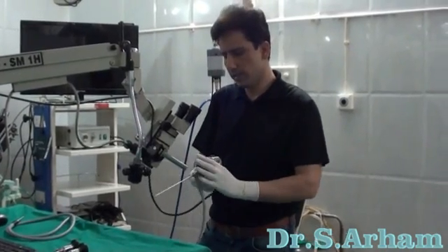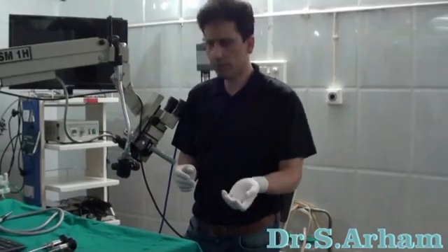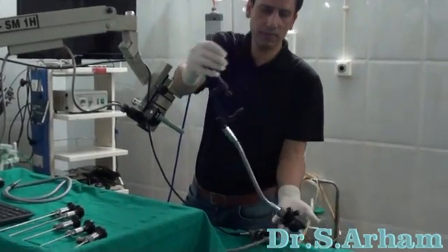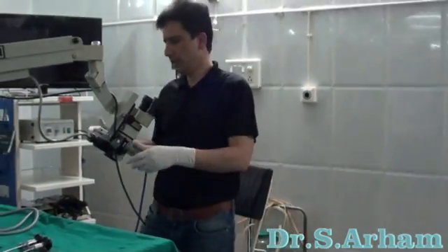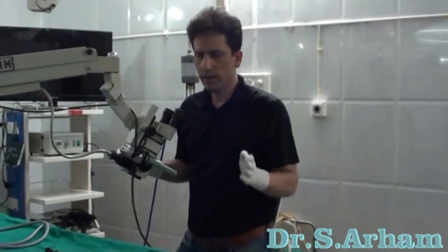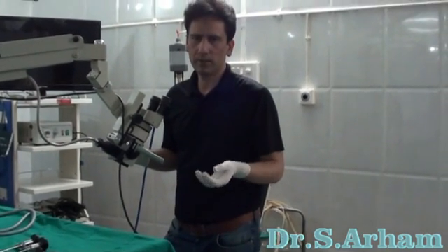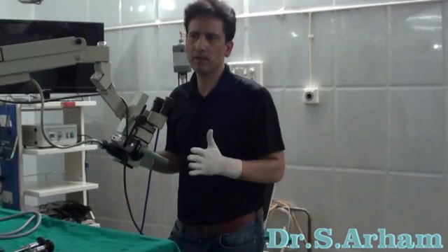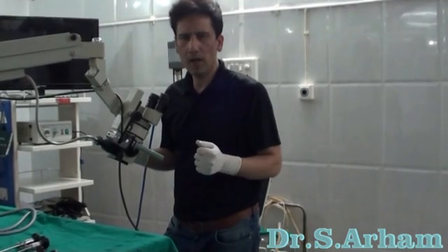Then I had designed the advanced endoscope holders. This was the first endoscope holder which I had designed. Any type of endoscope holder used in endoscopic ear surgery must allow you to switch over from endoscopic to microscopic ear surgery. You can shift from microscope to endoscope and back without losing time.